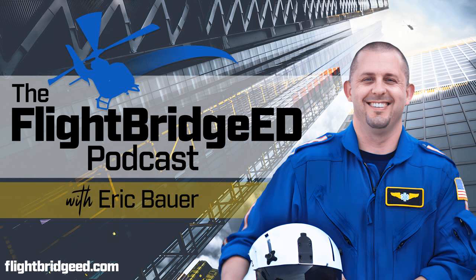All right, so obviously we want to try to correct the problem. We just don't want to switch modes. We just don't want to drop our tidal volume. We need to make sure that it's not because of over volume based on our high tidal volumes. Even though we're starting at 6 mLs per kilogram, that may just be too much and be causing excess pressure against the alveoli. So just correcting that may fix the problem, but there could be an underlying issue.